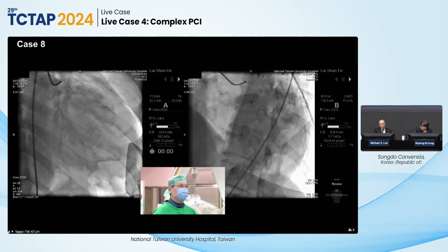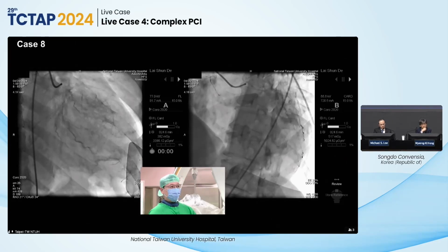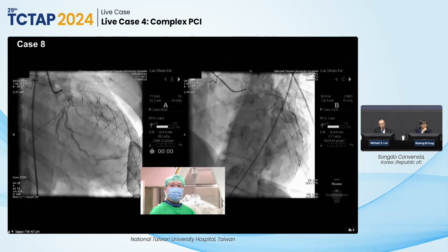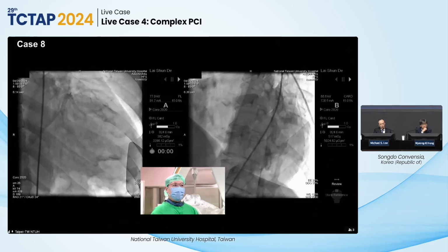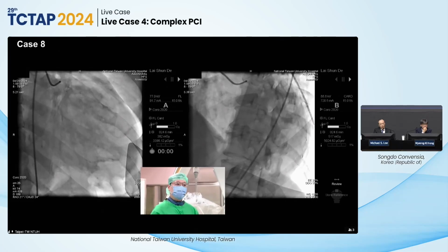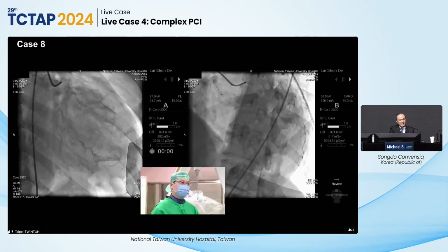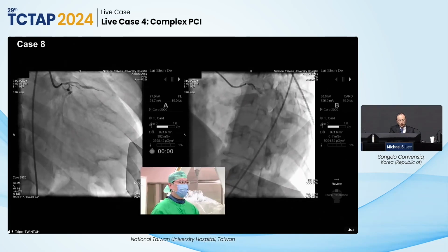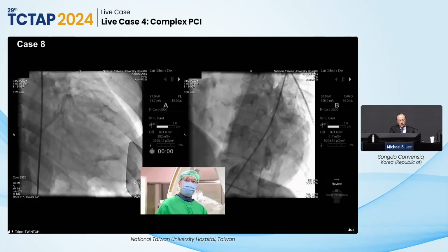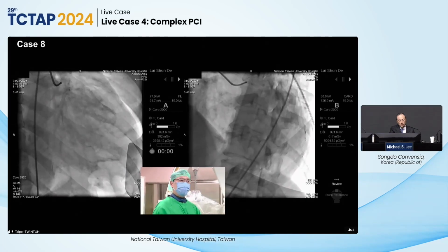Is it basically an ECMO system? Well, basically, it's also a ventricular assist device because it draws the blood from the ventricle and propels the blood into the aorta with a different mechanism. And we call it the IVAC2 because it generates about 2 liters of cardiac output per minute. Okay, so it does unload the left ventricle? Yes. Great. Do we have any data, like with PROTECT II and Impella, there is benefit at 90 days per protocol? Is there any data? I don't believe there is any head-to-head comparison, but of course there are definitely case series showing the effect of the IVAC system.